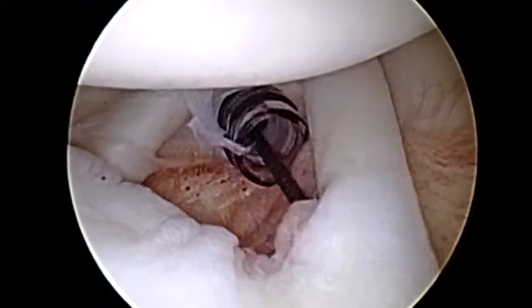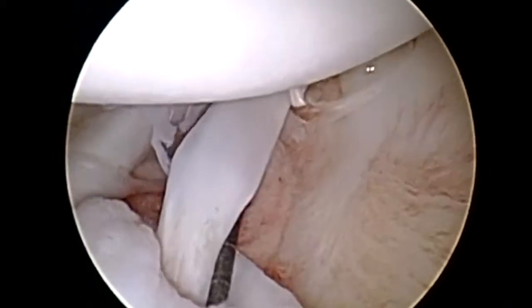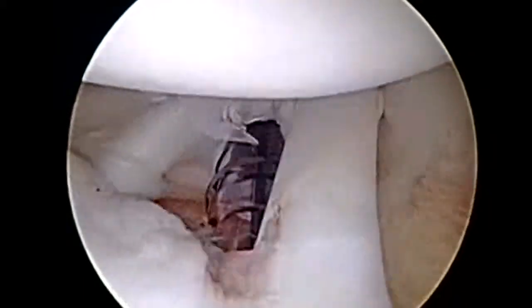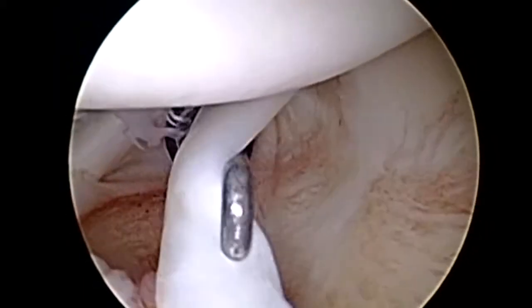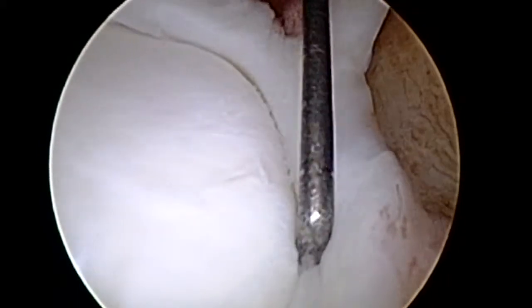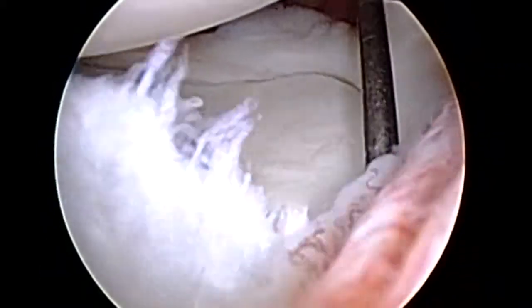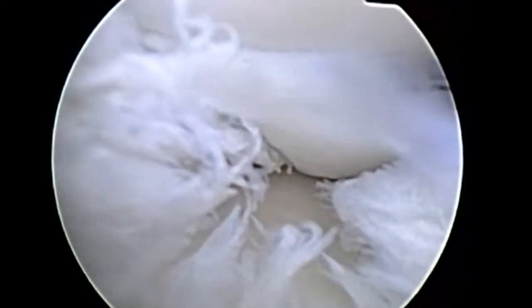As we start our diagnostic scope establishing the anterior cannula, we're evaluating structures in the anterior and superior labrum, including the anterior labrum itself, which looked great, the subscapularis, which was intact, and his biceps, which looks very healthy. He has no evidence of a SLAP tear, but as we pull back and look more posterior and posterior inferior, you can see a lot of torn, damaged labral tissue.